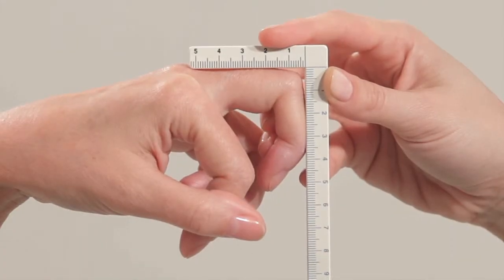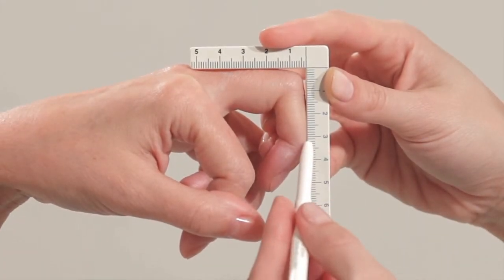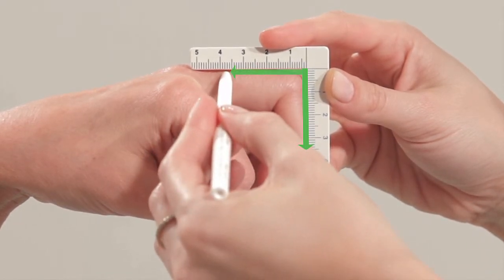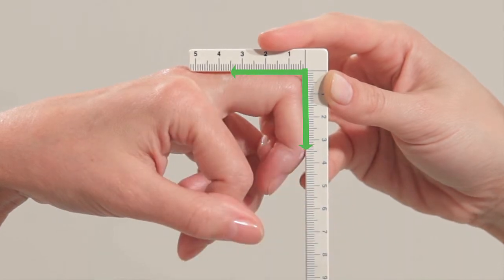Fit and align the gauge over the subject's finger. Note the length of the medial phalanx on the scale, find the same unit of length on the proximal phalanx, and mark the point.